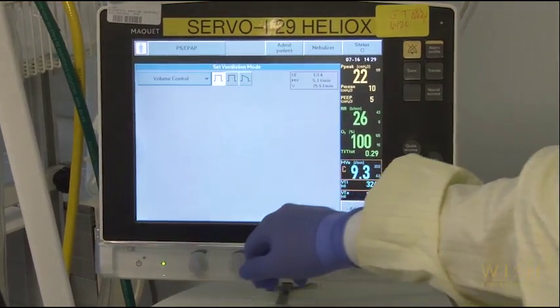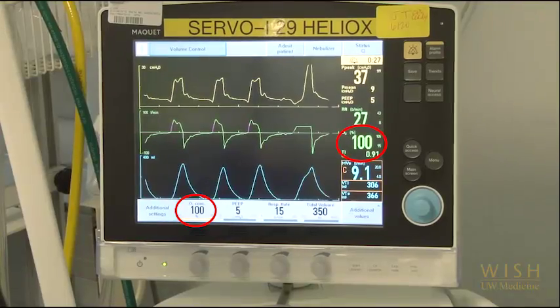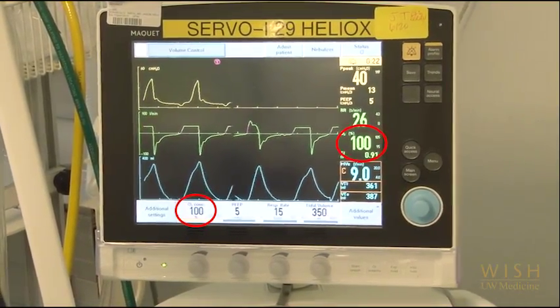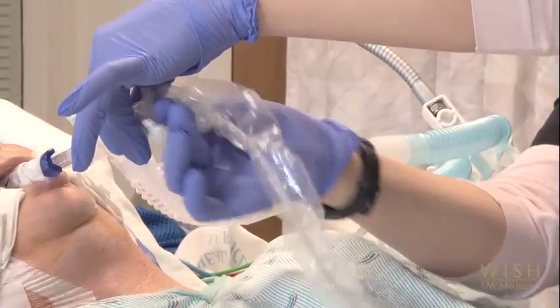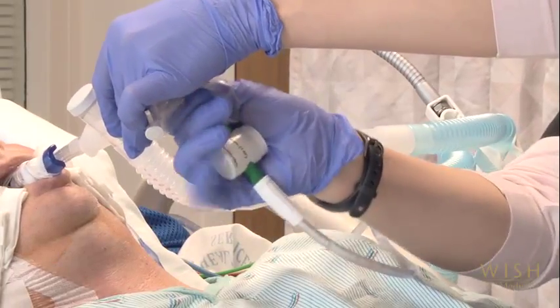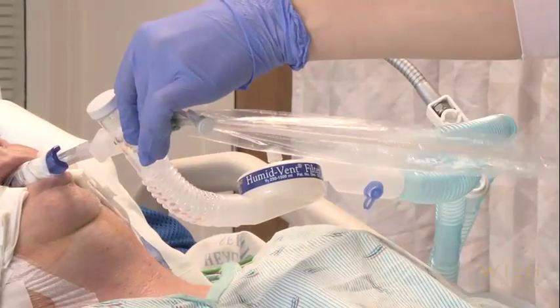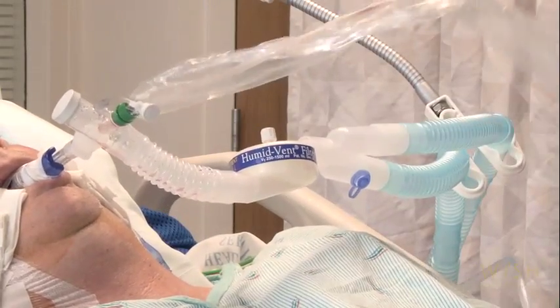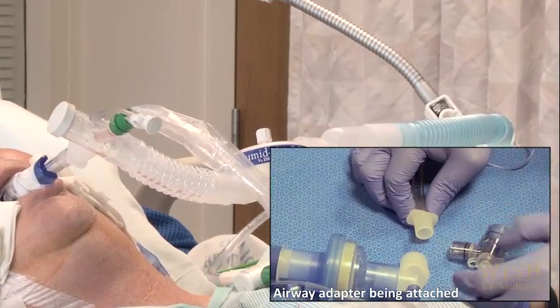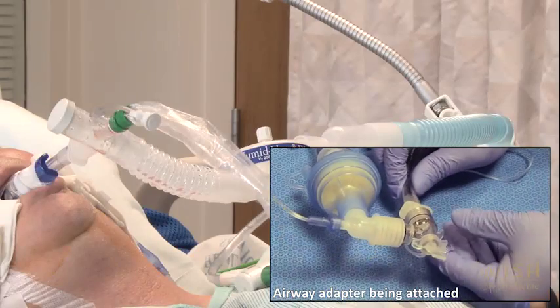Prior to performing bronchoscopy, pre-oxygenate the patient with 100% oxygen and administer pre-procedural sedation and analgesia. It is frequently useful in intubated patients to first perform in-line endotracheal suctioning to clear accumulated secretions in the upper airway and endotracheal tube, which is also a useful test to determine if the patient needs more sedation. In this example, 1 to 2 milliliters of 2% lidocaine can be administered via the endotracheal tube before the bronchoscopy adapter is attached, to dampen the patient's airway sensitivity.